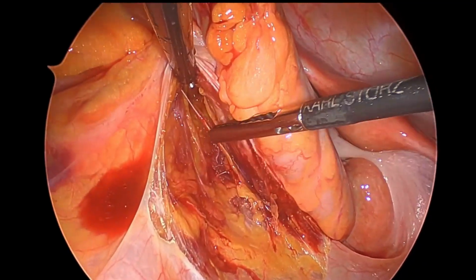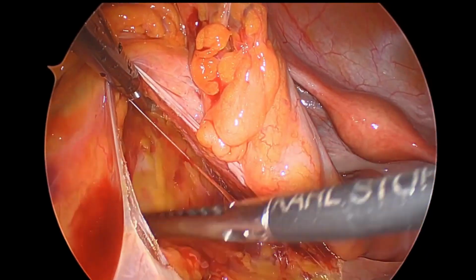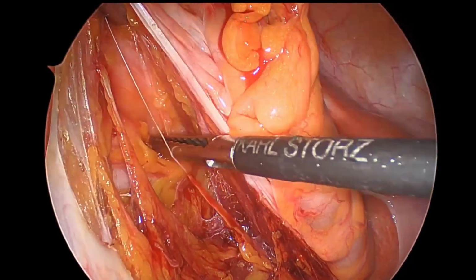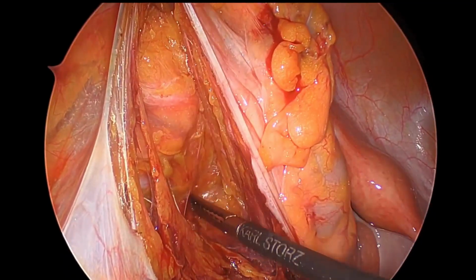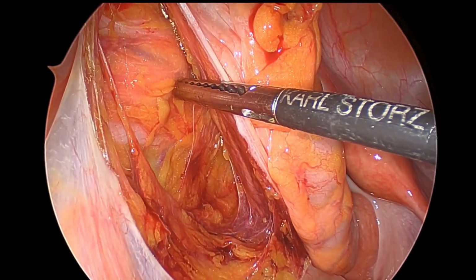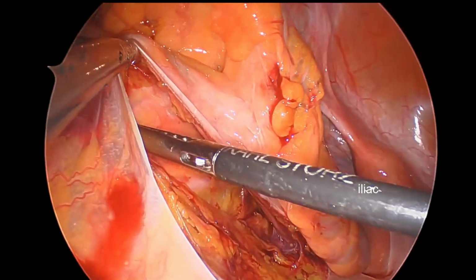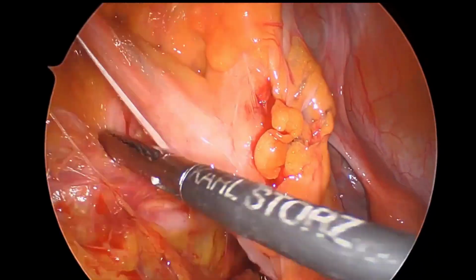And so here you can see that there's a little bit of blood, and one of my tips was bleeding is bad. So anytime there's even a little bit of blood, you have to question if you're in the right plane. And there you saw that we could visualize left common iliac, and that is an indication that we've gone too deep. And so the maneuver here is to actually try to get the plane reestablished. And to do that, we see the left common iliac again. To do that and reestablish the plane, we're going to withdraw our left hand and try to open up that window even further. And now you can see that we've found the right plane again.